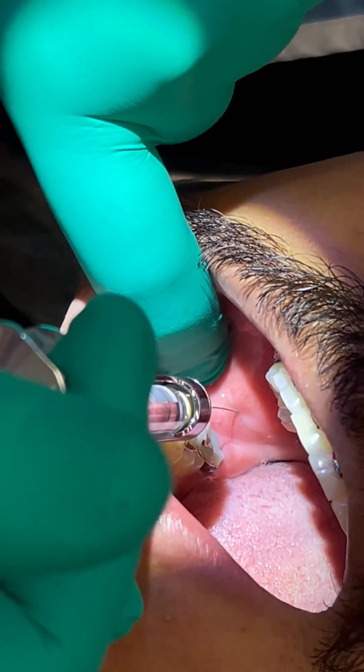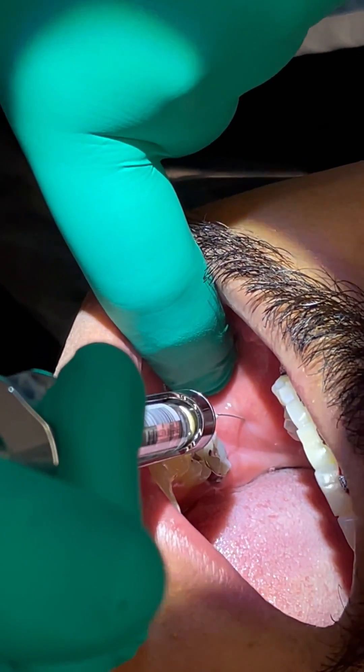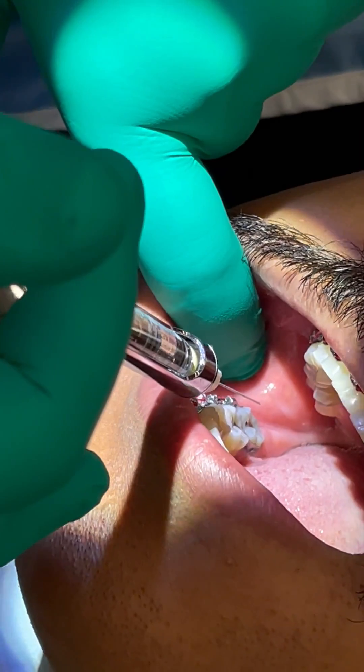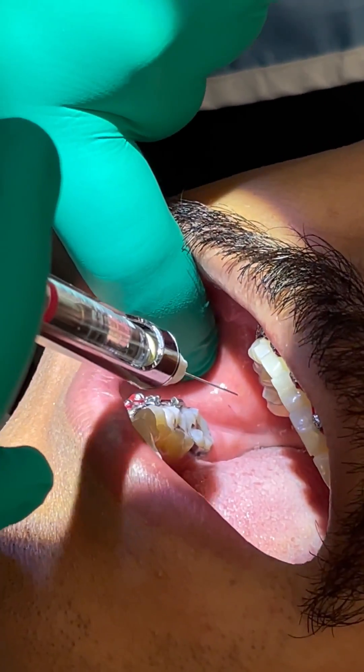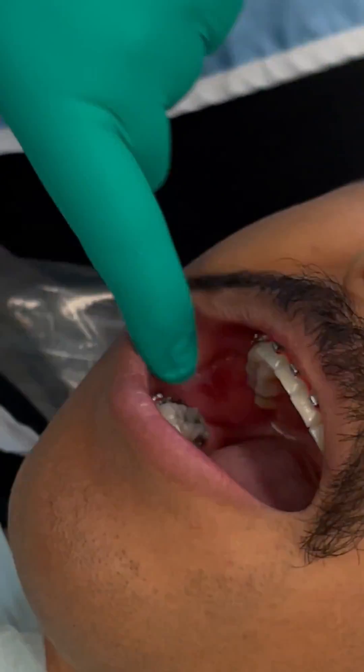Then you just inject about half a carpule. You can see I'm about four millimeters above the occlusal plane. You can give this a little bit faster because it's really easy, and honestly you can inject here, here, here, or here — you would get it in all of those places.